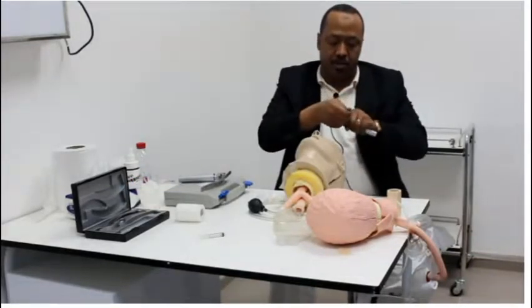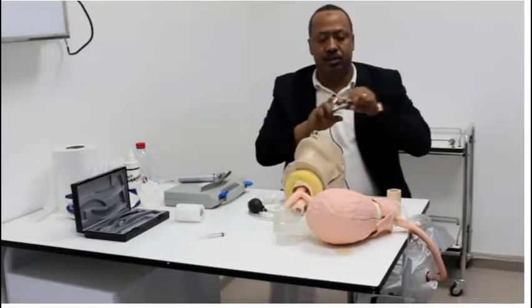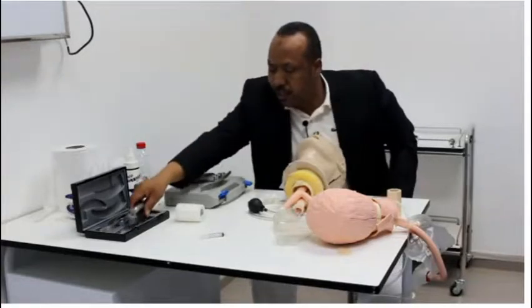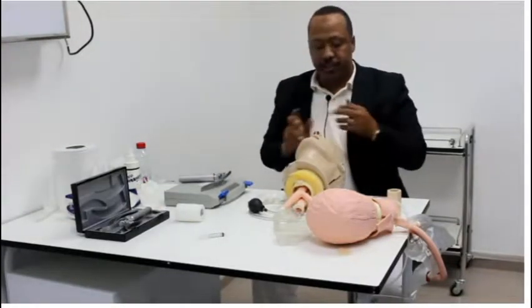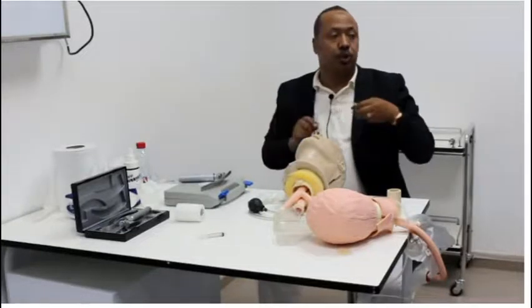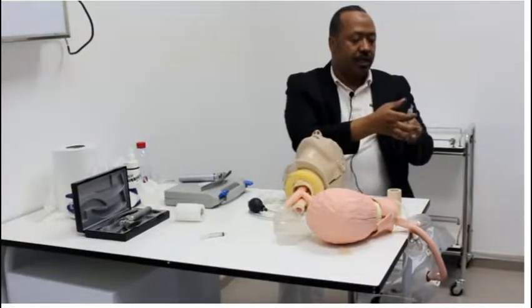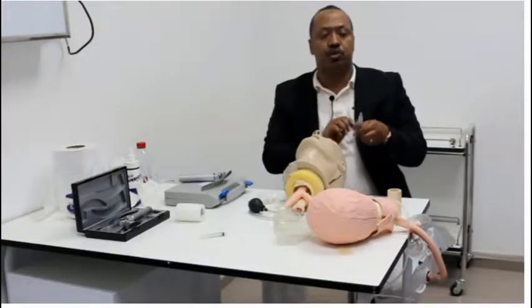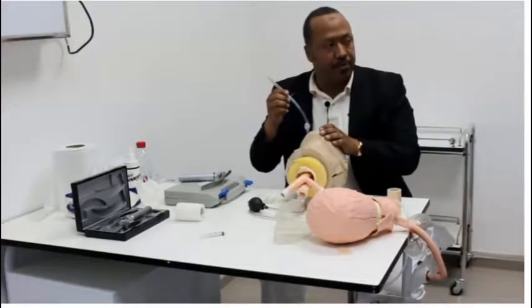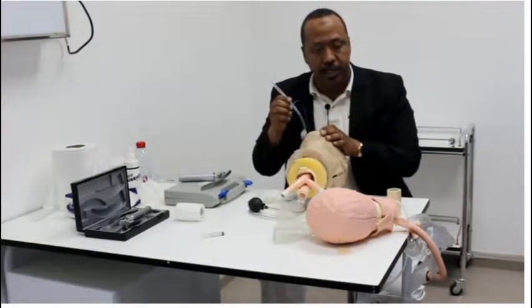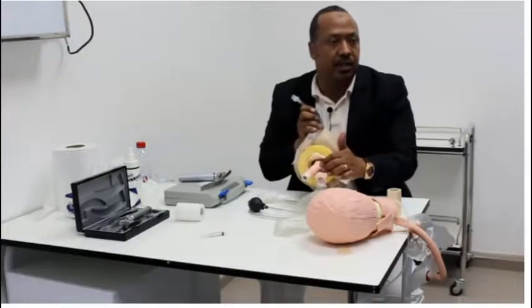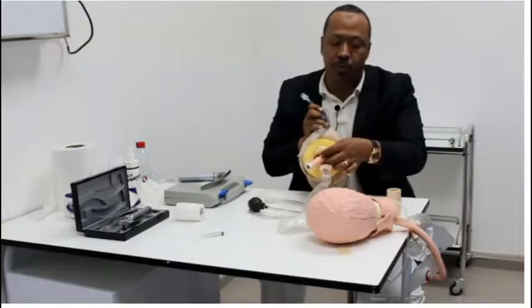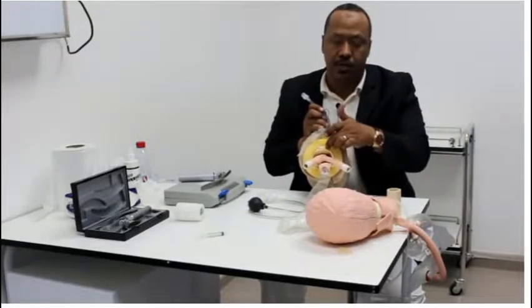We have to make sure for the tube. The tube has a balloon. The balloon is supposed to be inflated. How do I put the tube? The target is when I enter the vocal cords, I enter the trachea. I should start midway. You know this is the carina. The tube I don't want to enter the carina. I don't want to enter the bronchus. I should stop midway.